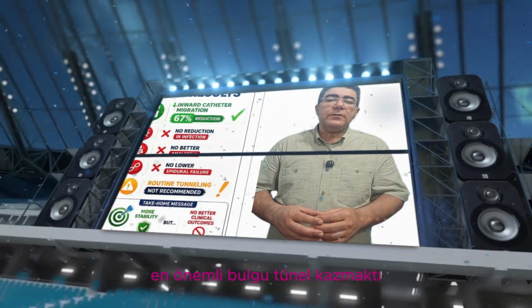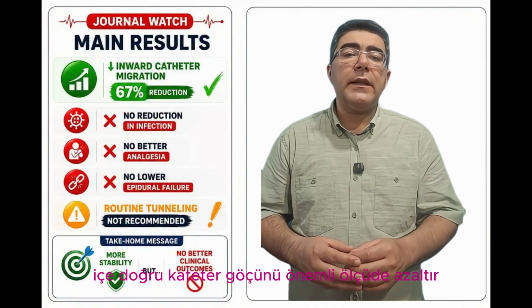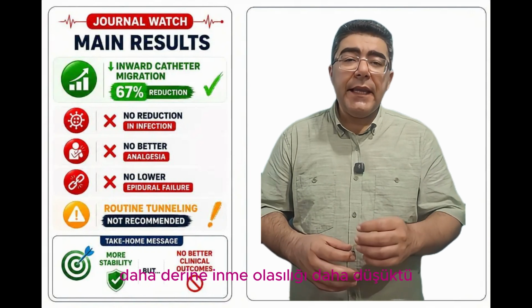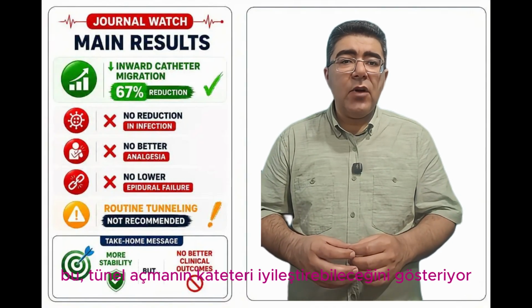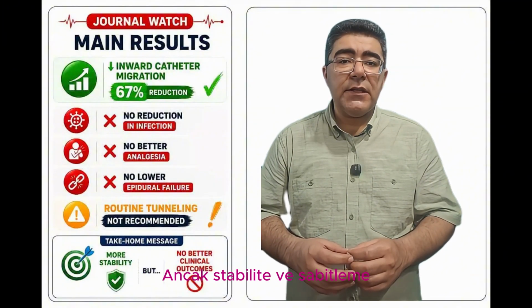The most important finding was that tunneling significantly reduced inward catheter migration. In other words, catheters were less likely to move deeper into the epidural space when a tunneling technique was used. This suggests that tunneling can improve catheter stability and fixation.